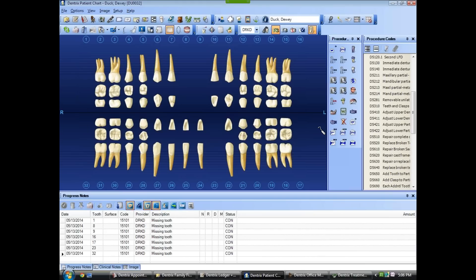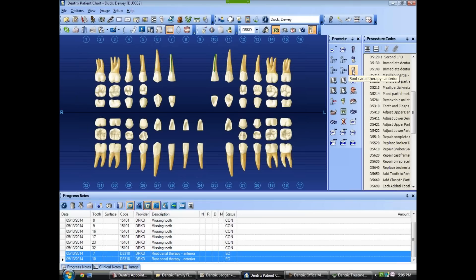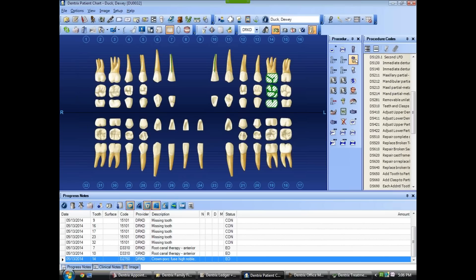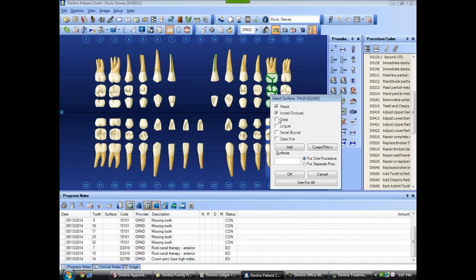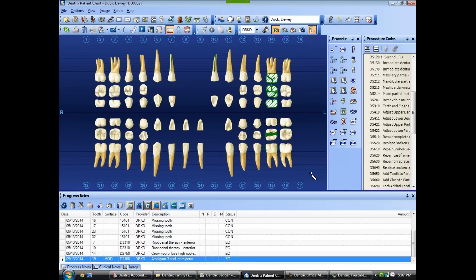The patient has endos on teeth 7 and 10, and a crown on number 14. On number 19 there's an MOD amalgam, and there is an MO composite on number 31.